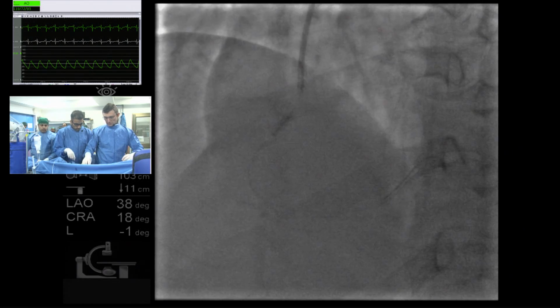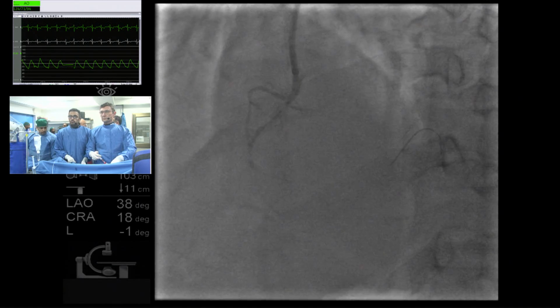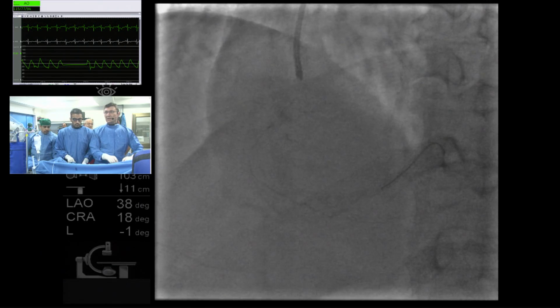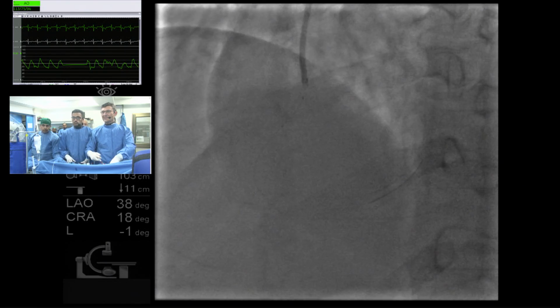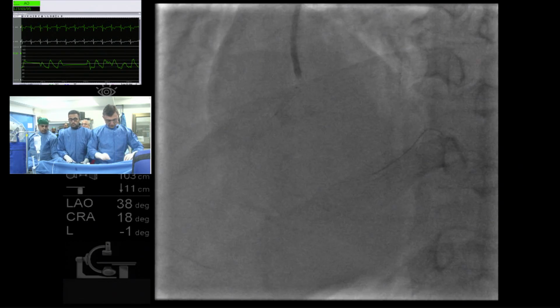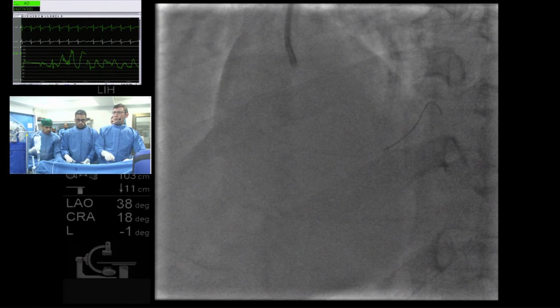14? But we have to confirm, moving slightly proximal and distal, and then finally we decide, right? Because with the shorter diameter, I feel that you can expand it. I think we dissected a little bit. Yeah, makes sense. I think we're done with pre-dilation. So what do you suggest for the stent diameter?